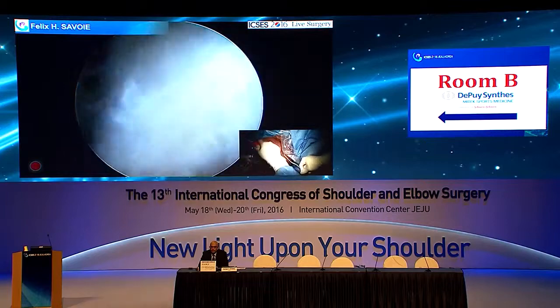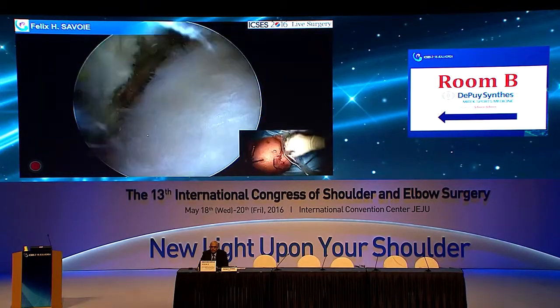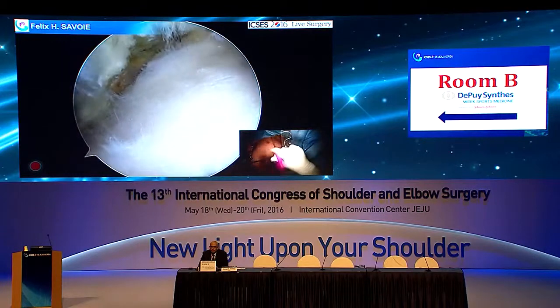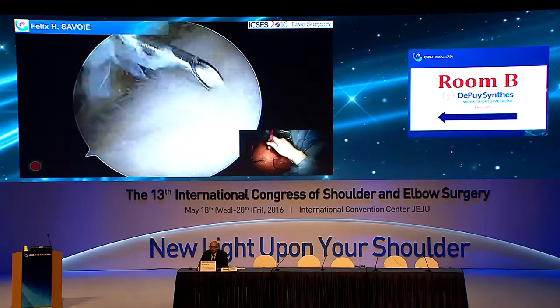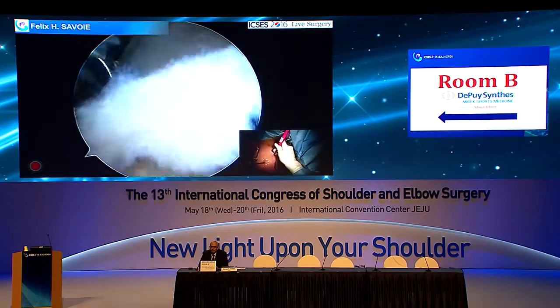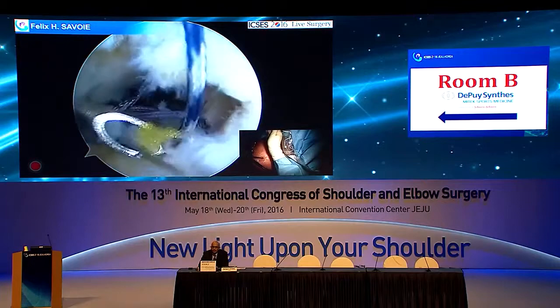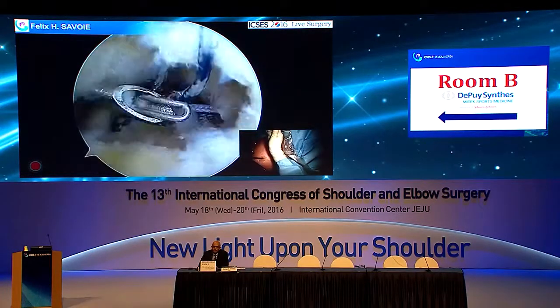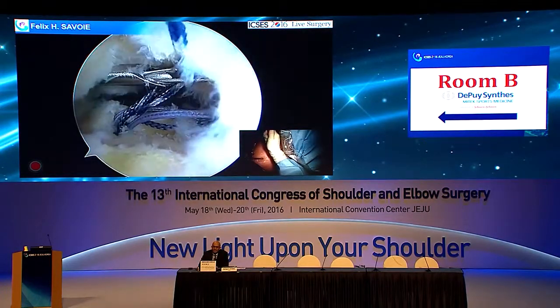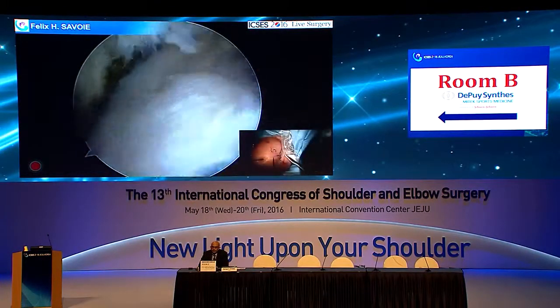And then we just make sure we don't offload that. Okay, and then we have one more. So I can either come from here or I can come over from the front, take a look at it and go, I think I want to bring this over just a little bit. And this is a nice way to do your biceps if you want. And then, whoops, sorry, my bad. So then see, I'm always going medial to the undersurface part of the tear.